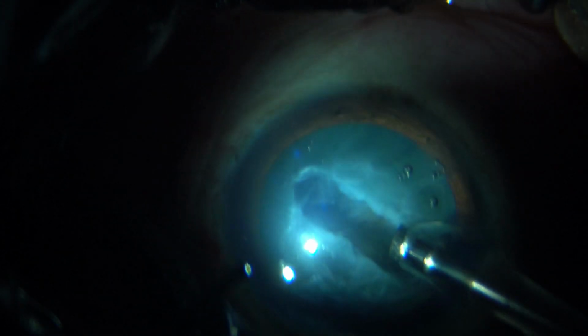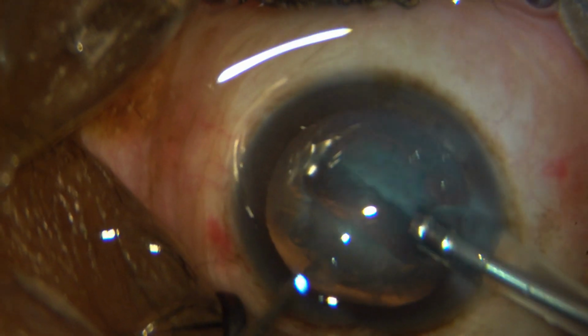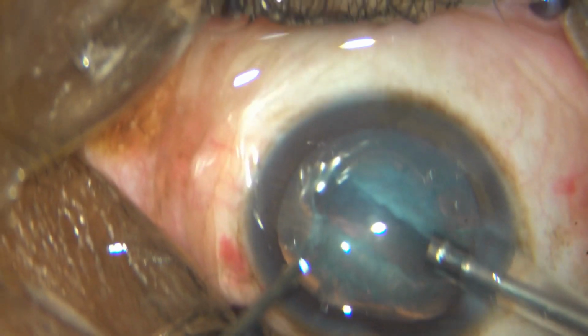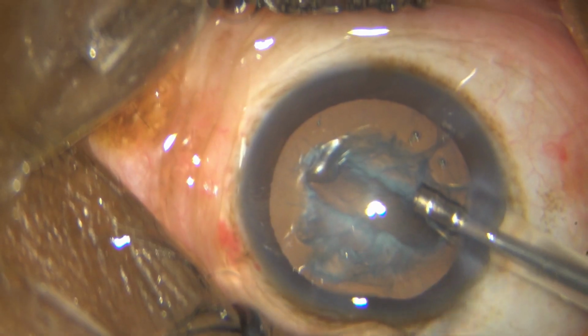So in that way, this really helps you to gauge the crater much better than your coaxial illumination, with all the other difficulties, of course. I just thought I could use the endo illuminator as a second instrument, but then I abandoned it just to show you the picture from the endo illumination from outside. And there I put on my microscope light, and you can see that's a pretty good trench. And there is a posterior plate as well, so pretty safe.